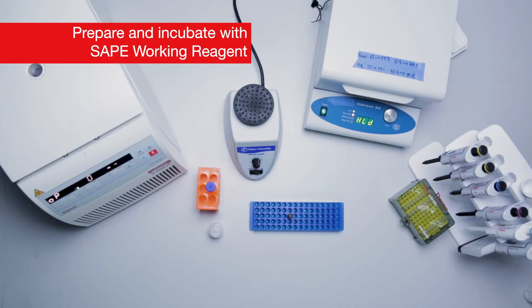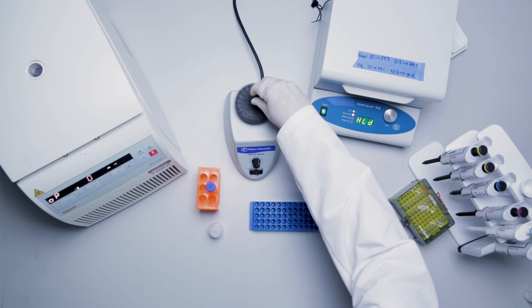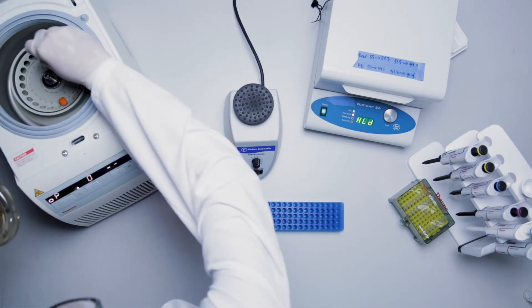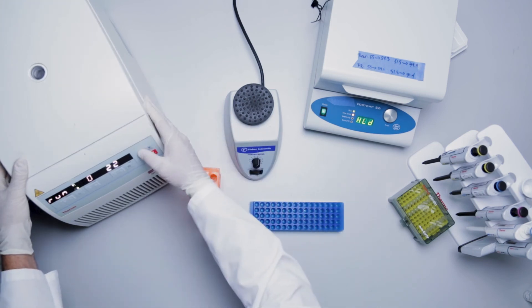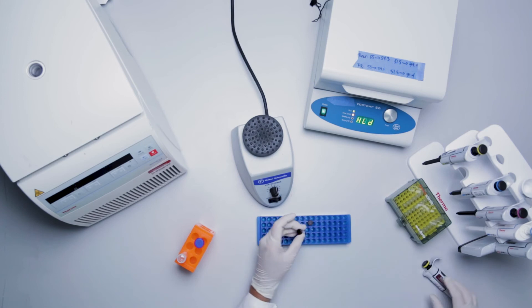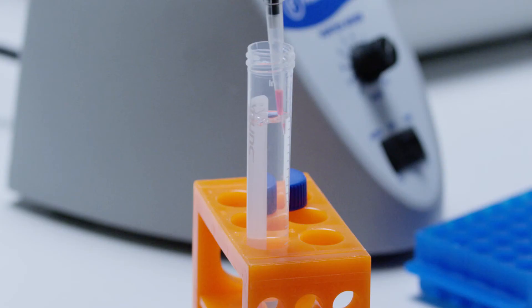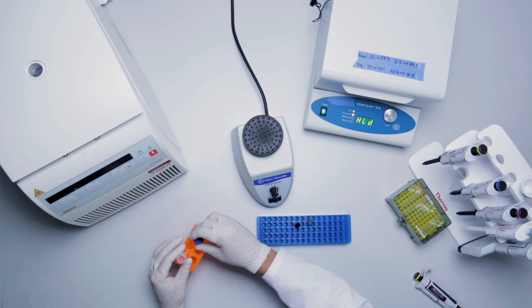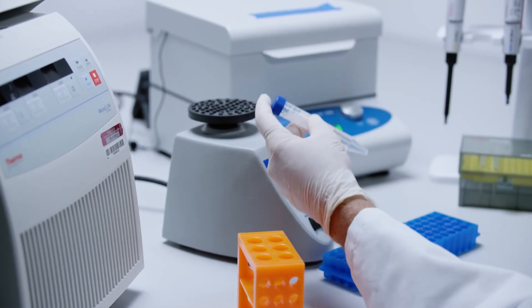With 5 minutes left of the label probe incubation step, prepare the SAPE working reagent by briefly vortexing the SAPE concentrate. Briefly centrifuge to collect the contents at the bottom of the tube. In a 15 milliliter tube, add 36 microliters of SAPE to 12 milliliters of SAPE diluent to make the SAPE working reagent for a full 96-well plate. Scale accordingly if running a partial plate. Vortex for 15 seconds to mix and protect from light.